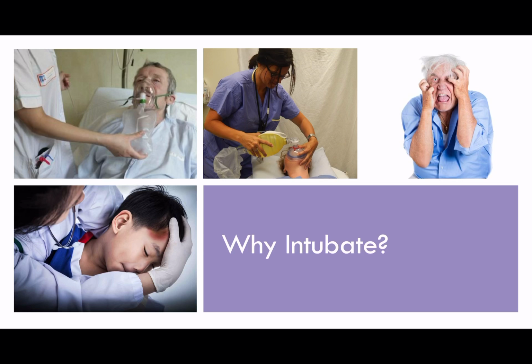And therefore, a secure airway is really an airway where there is some way of preventing secretions from dropping down into the lungs. Another group of patients for whom intubation may be required are those who are very agitated.